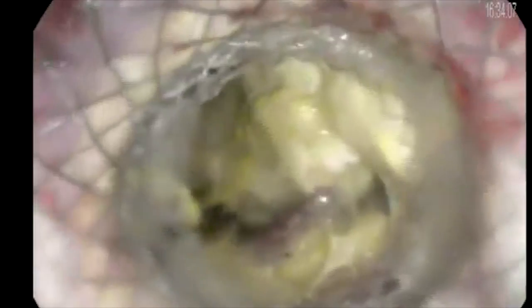You may stop at this point, or you may consider dilating the cavity with a 15-millimeter balloon. You can also look inside the cavity to assess the amount of necrosis. As we can see, the procedure that previously took 30 to 40 minutes now takes less than 10 minutes using the hot lumen-apposing metal stent. Thank you.